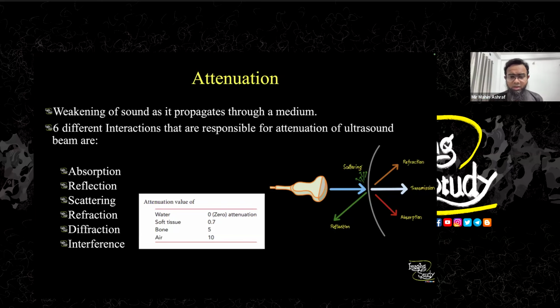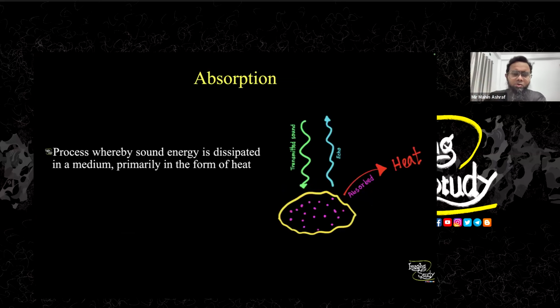The main important thing is that water doesn't create any attenuation. It has an attenuation value of 0, so it won't disturb and the sound will go very smoothly without any impedance. For soft tissue, there is some attenuation, and air will cause a huge attenuation. Bone, you know, reflects all the sound, but air is more notorious with a very high attenuation value. That's why we don't like air. Okay, live a life without air.